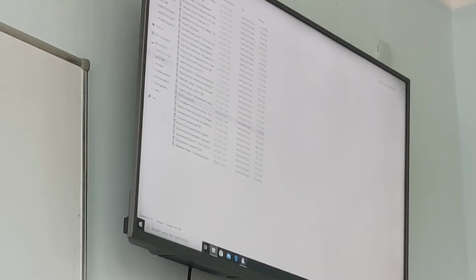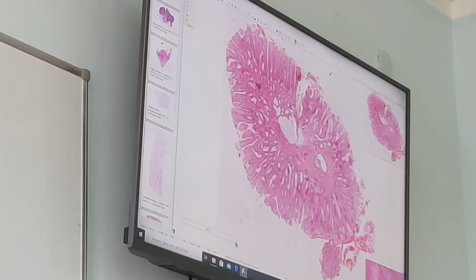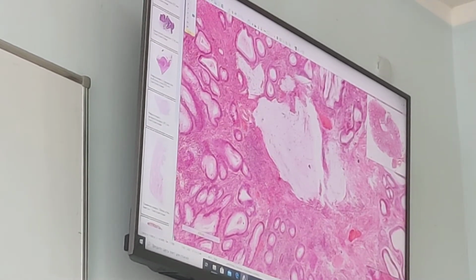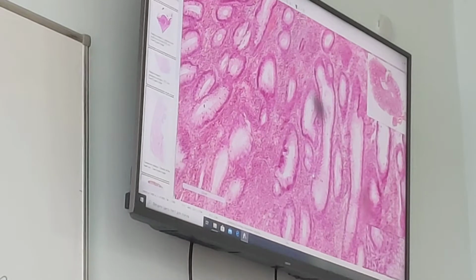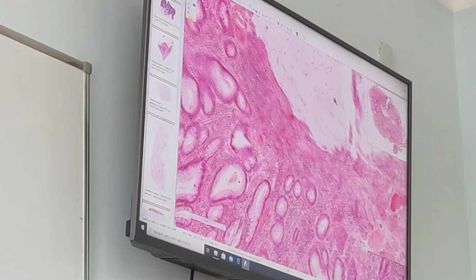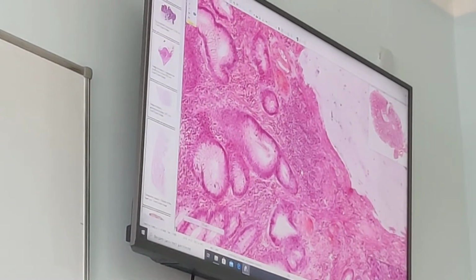Intestinal polyp. Polyp of intestine, it's a benign tumor-like condition consisting of peduncle in the center and cap on periphery. Peduncle, as I told before, consists of connective tissue and blood vessels. Blood vessels are filled with blood cells, so you can easily find them due to red color. Cap consists of multiple glands and stroma between them. Glands have different shapes, but they are normal, oval, round in shape. Between them stroma, connective tissue, and connective tissue has some signs of inflammation, accumulation of lymphocytes and macrophages.